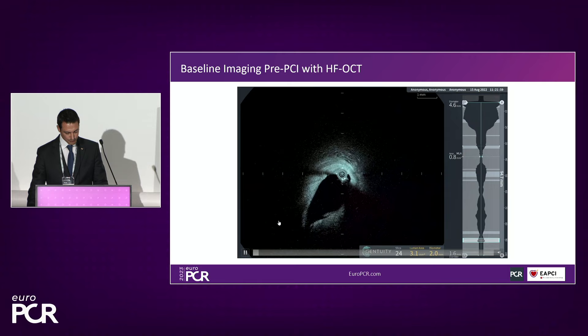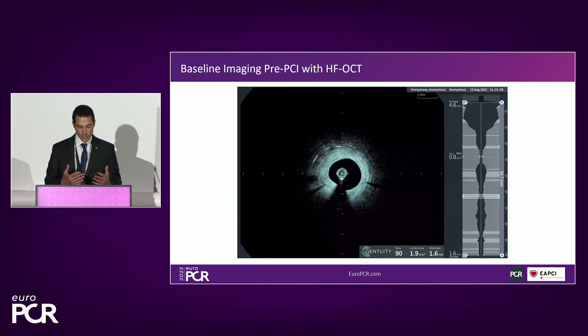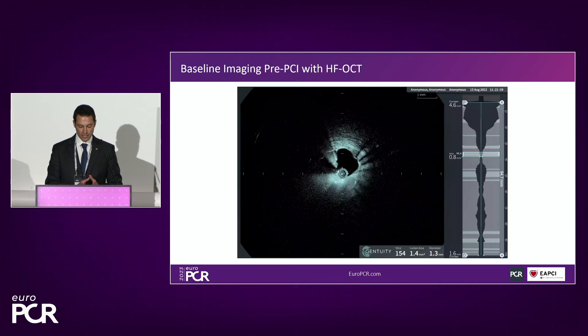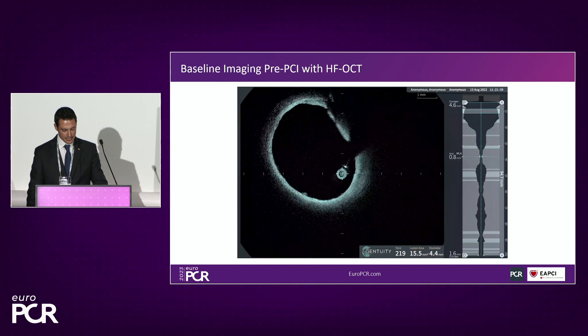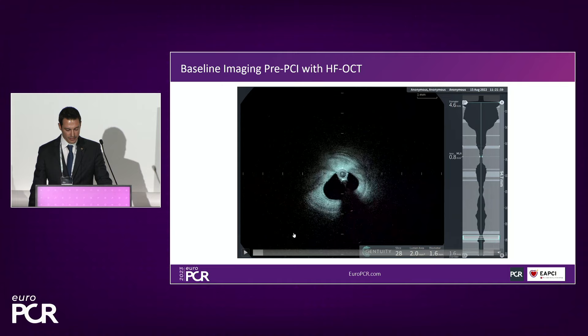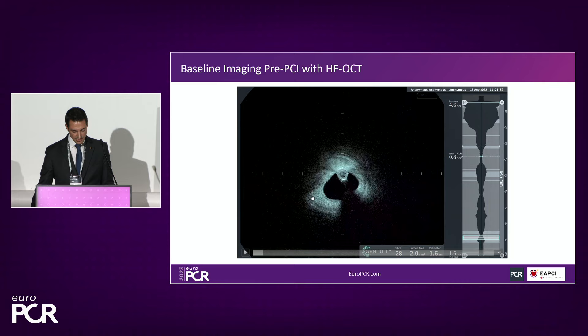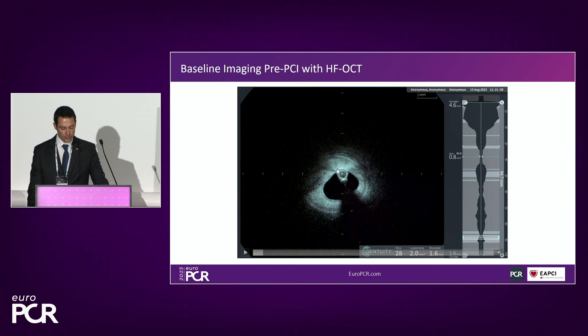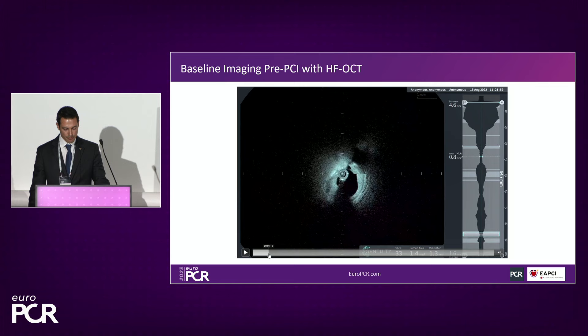Playing through the pullback from distal to proximal, one thing that stands out with this diffuse critical stenosis is a completely clear imaging field — which makes the image interpretable. Starting distally, we see a small vessel with no blood swirl. Despite the presence of diffuse disease, we can see the EEL nearly circumferentially, giving us clear EEL visualization with a completely clear lumen field, even in a highly stenotic lesion.